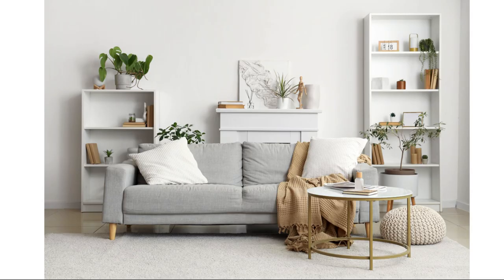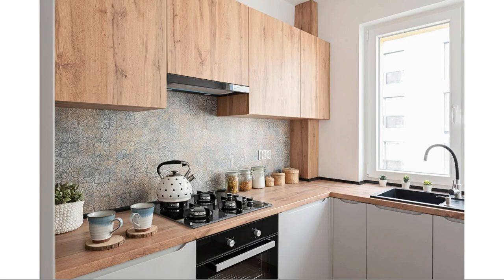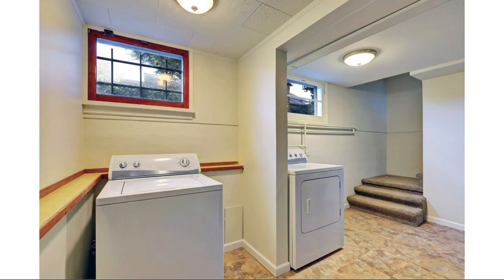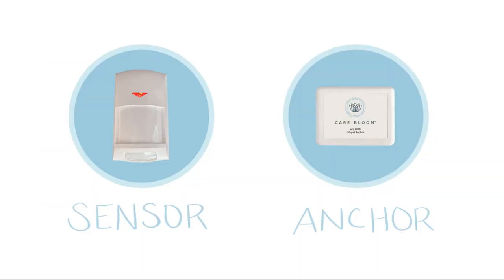Next, consider what rooms you would want to monitor. The CareBloom kit has sensors for 5 rooms. Consider high usage rooms or areas that pose a fall risk, like the basement. Each room will have a sensor and an anchor.